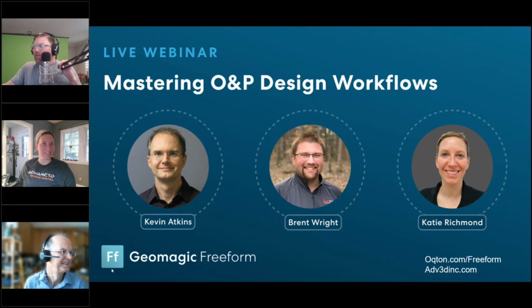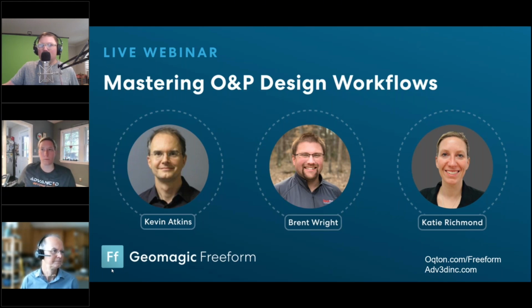Another question says other CAD and design suites have student or demo versions for training. Does Freeform have this option, knowing that you need a haptic pen to take full advantage? Great question. You can do stuff with a mouse, but it does hamper your ability to do a lot of things. I know some people who have done Freeform with a mouse. This is the funny part: they had a haptic device, never plugged it in, and only used a mouse. I said, you should use the haptic device, it opens up a whole new world. He goes, no, I'm good, I've got a mouse. And I go, I'm serious, man.